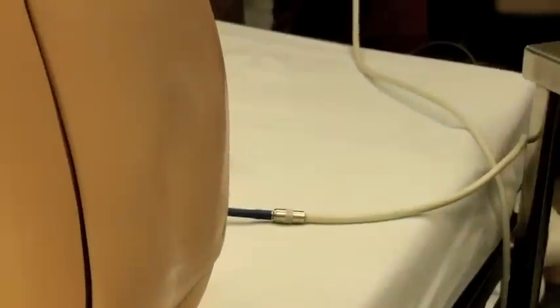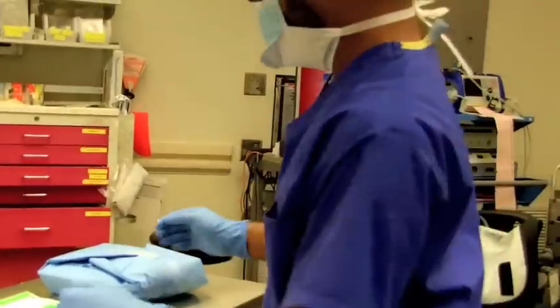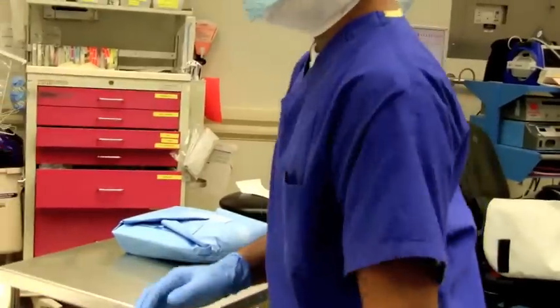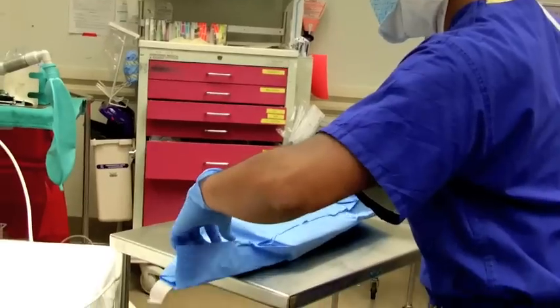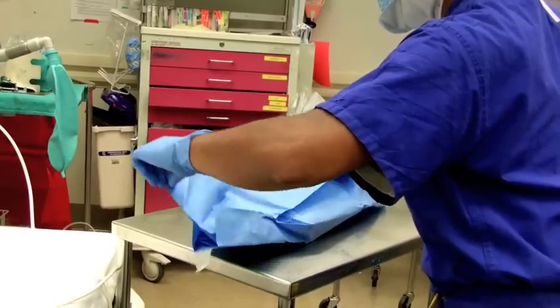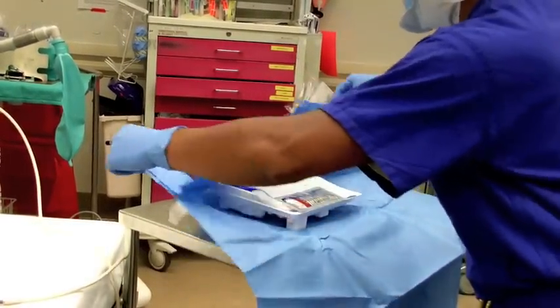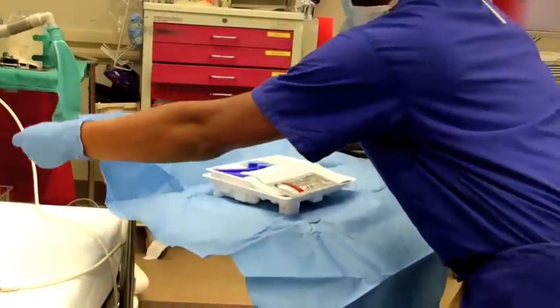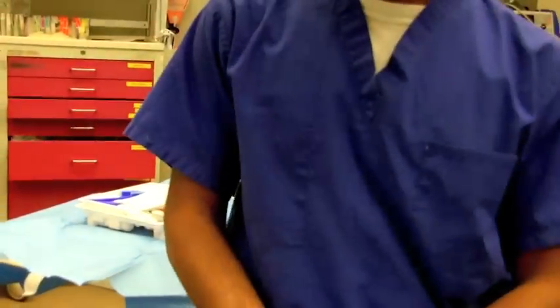Step 5. Open the spinal tray before placing sterile gloves on. I will now open the spinal tray. Step 6. Put on sterile gloves with proper technique.